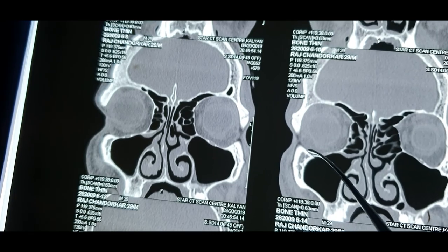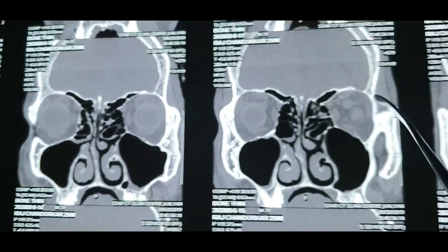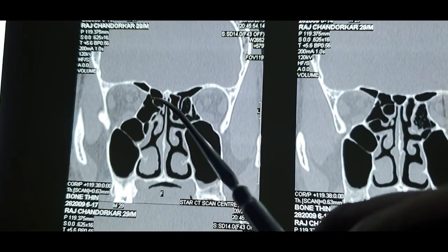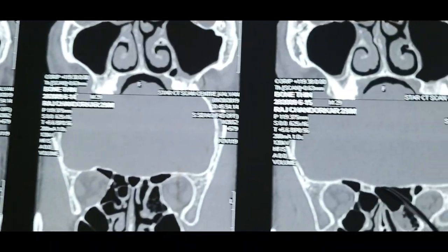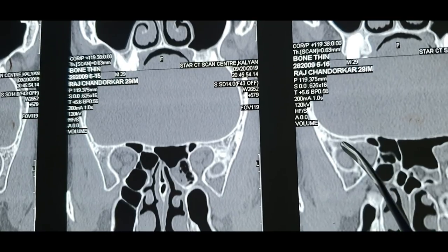And what is the fifth change? The thickness. This is thin. Anterior ethmoidal skull base is thin. So this is the posterior, it becomes thicker now. See the integrity? It becomes thick. It keeps on getting thick and flat. Thick and flat. See this? The thickness? See the thickness?